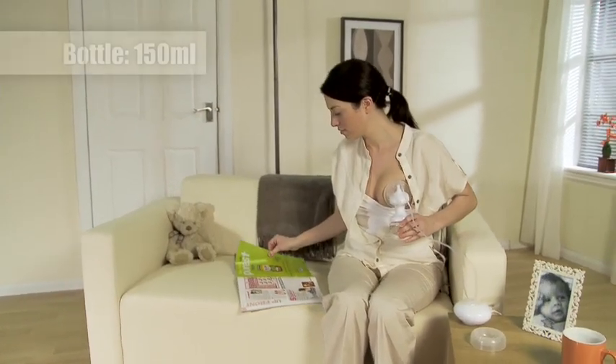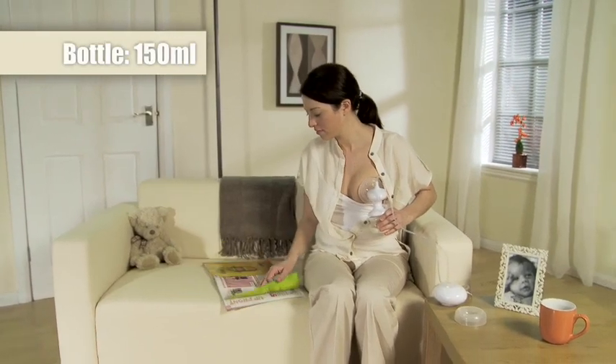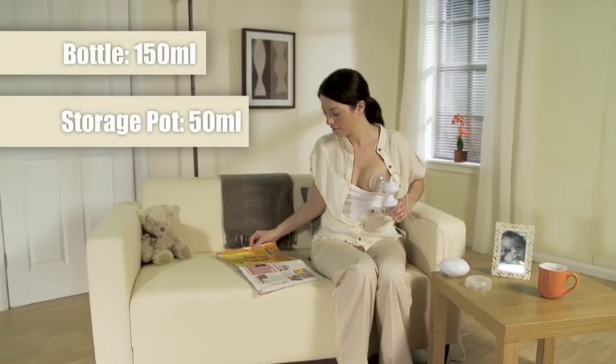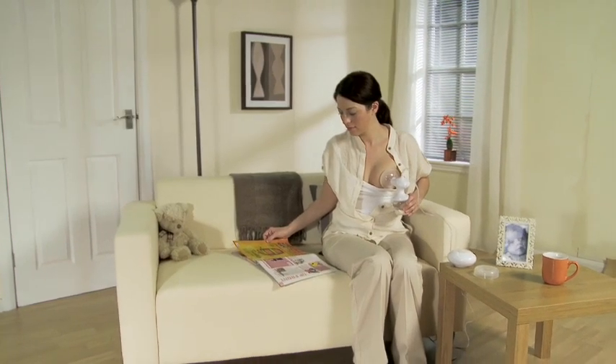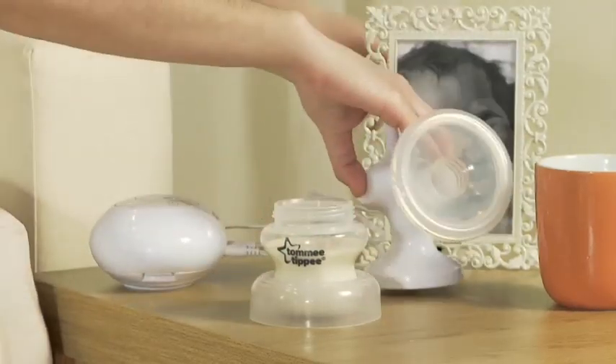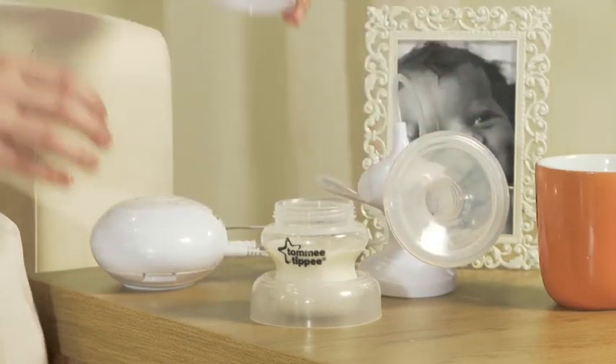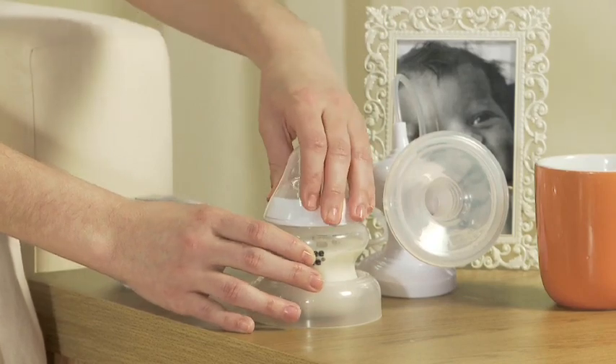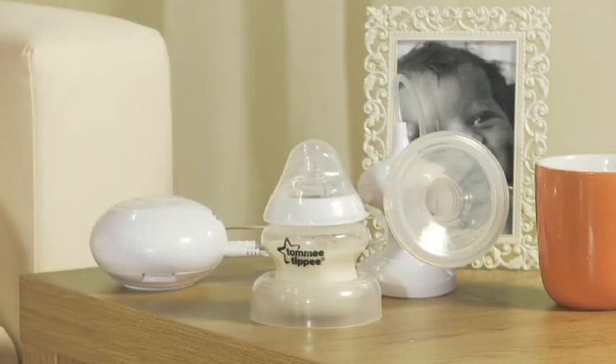Take care to finish expressing before you reach the 150ml mark on the bottle. If you're using one of our storage pots, finish before you exceed the 50ml mark. When you've done, switch off the pump and unplug it from the wall. Unscrew the bottle from the breast pump and seal it. If you've expressed into a milk storage pot, place the lid on first and then detach the pot from the pump.